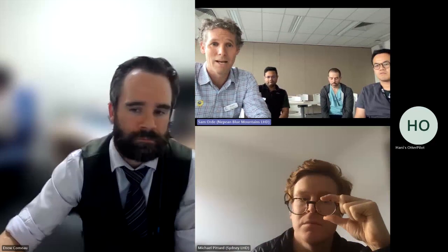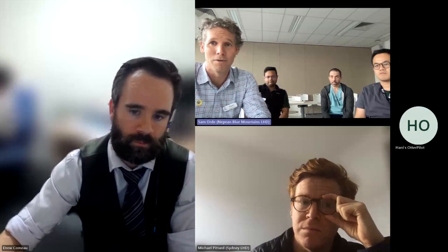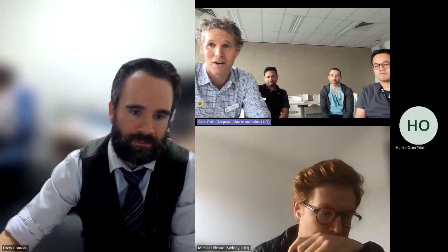I think we could provide significant evidence to show that it is useful, but evidence is needed. Evidence in the critically ill is not out there at the moment, and you're more than welcome to start trying to help us. Maybe this is where larger studies, looking at how many times we can't figure out regional wall motion abnormalities or ejection fraction accurately in the critically ill, even when you've got decent people doing it, would be a great place to start.